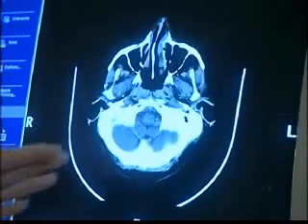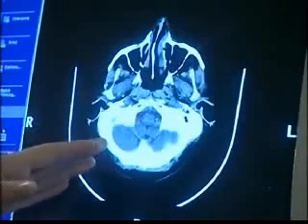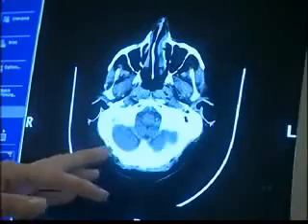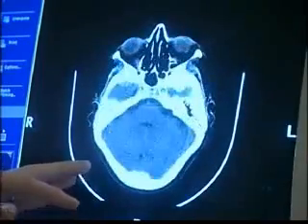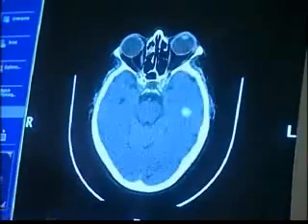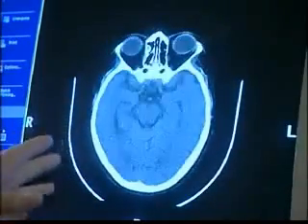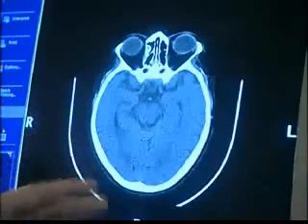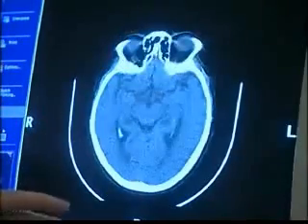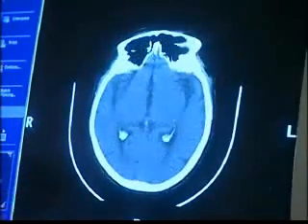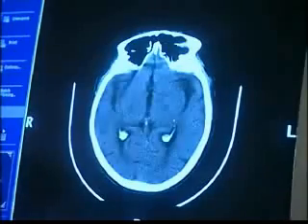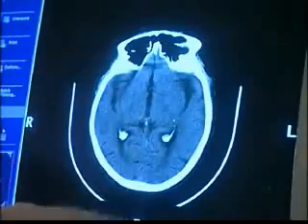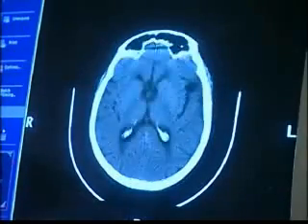What we'll do is look at the actual brain windows first. Going through, we're just looking basically for any asymmetry or any abnormalities. When we get further up, we can change the window levels so we can see the ventricles better.